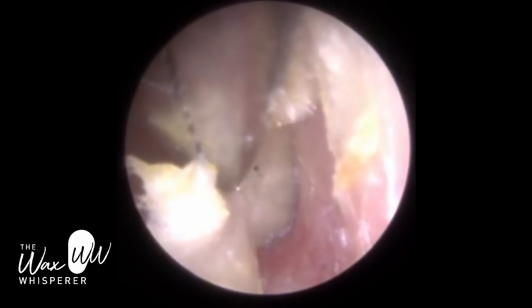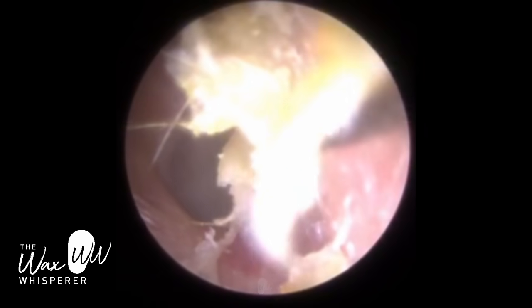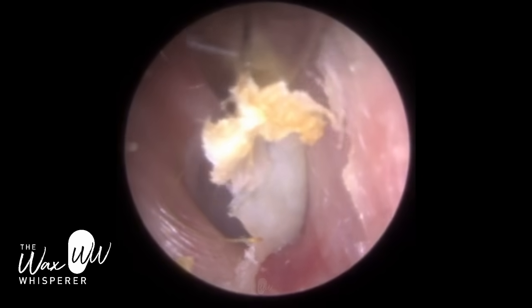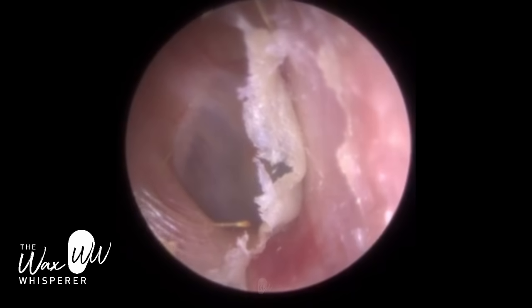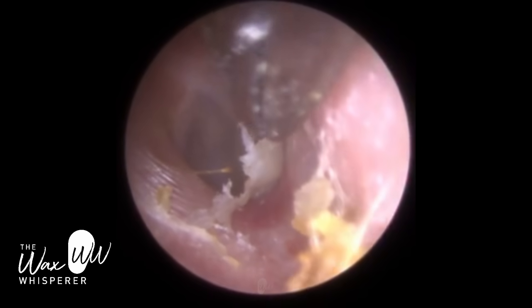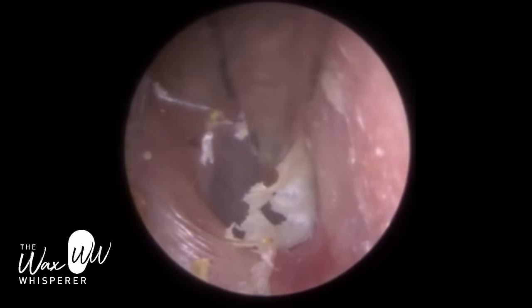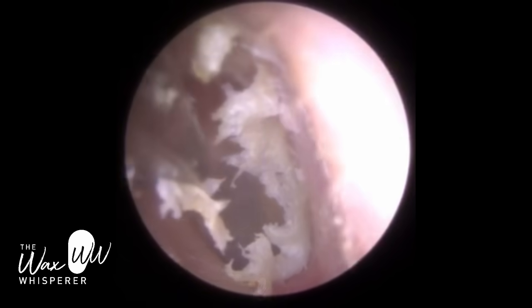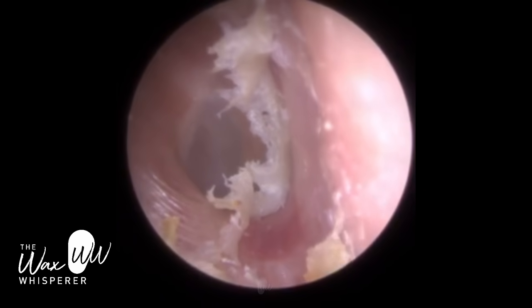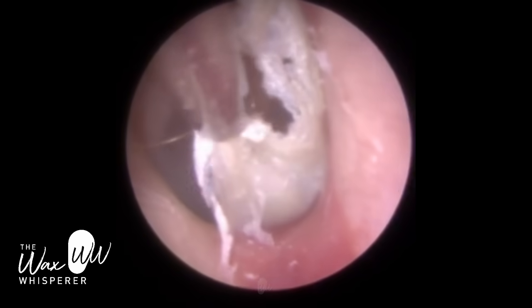Just really trying to tug onto this dead skin - it's very thick and extremely adhered to the canal wall. My main reasoning for removing this dead skin is that this skin is not going to shed. It's been there for a long time already and it's very thick. I'm hoping the undergrowth - the fresher layer, the next layer of epithelial skin cells - does migrate. Because if the skin doesn't migrate out of the ear, then earwax won't migrate out of the ear. So as the skin sheds, it's a conveyor belt - it's got that conveyor belt motion - and the wax that sits on top of the dead skin also then naturally migrates out. But it can only do that if the skin sheds. So I wanted to remove as much of this dead skin as I don't feel is going to migrate because it's too thick.